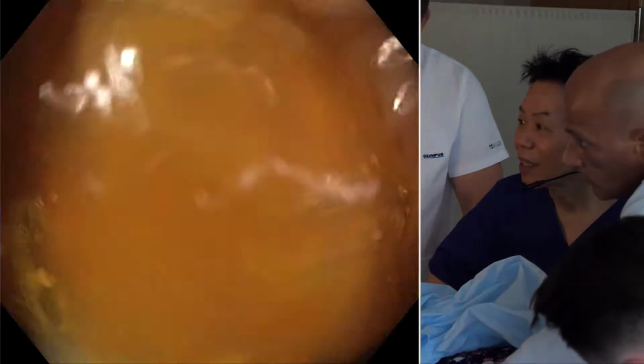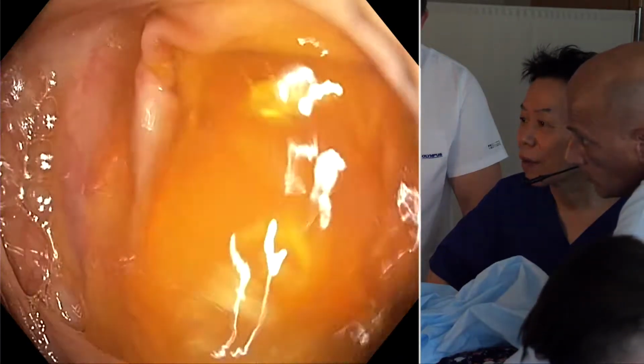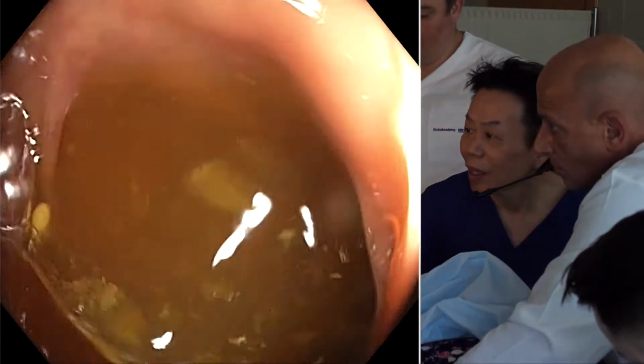Now I'm looking for the ascending colon. I push a little bit, but now I'm pulling back a little bit until I see the lumen. I push again. Clockwise rotation and up angle is very important. And pull back a little bit, pull back until I see the ascending colon. I'm still pulling back. Now it's better.